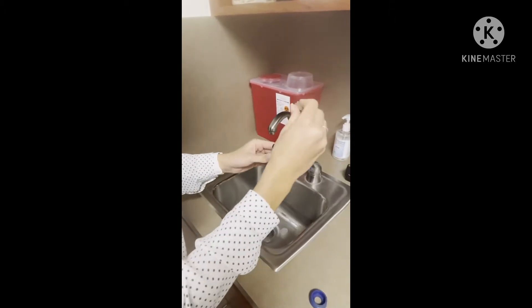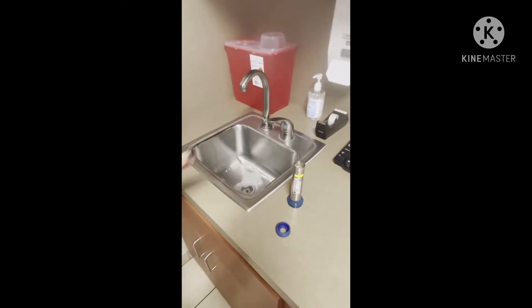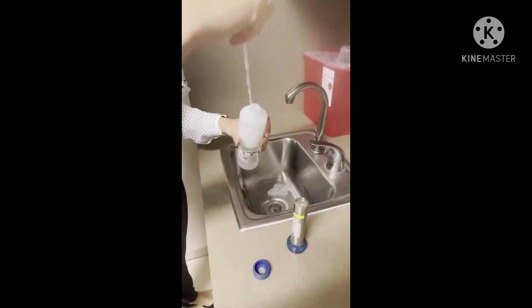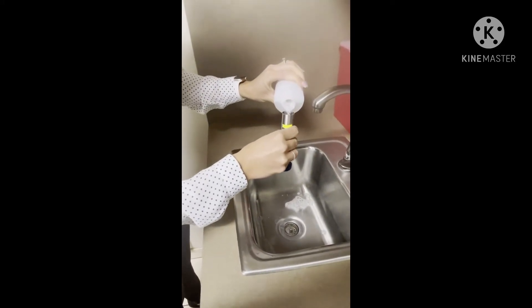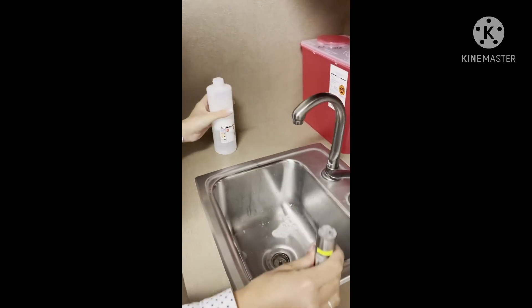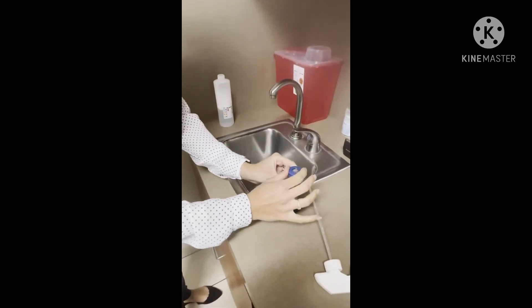Once that is done, you put this back in like this. Then you're going to take your scrub solution that you made and pour it in there. This should be done in every exam room once a week.